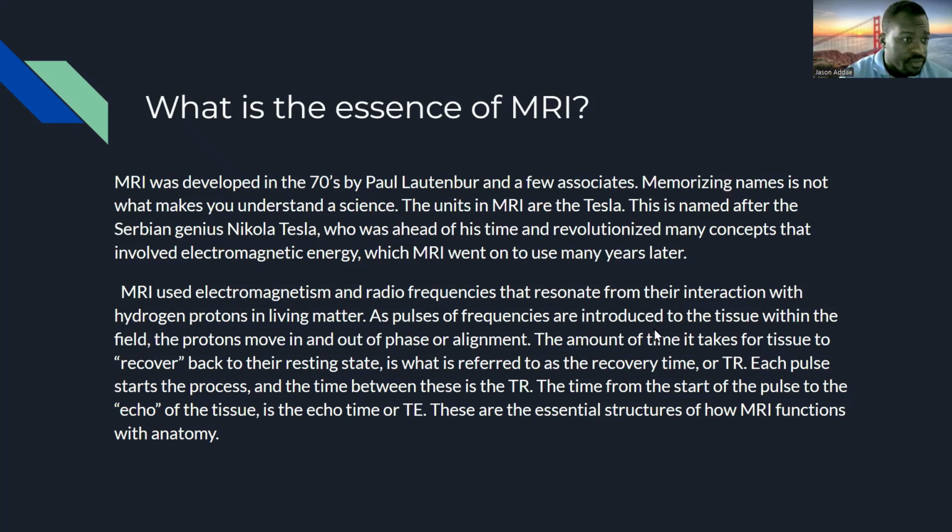Each pulse starts the process, and the time between these is the TR. The time from the start of the pulse to the time of the echo of that tissue, that's the echo time. I always imagine it like the consistency of matter, almost like catching up to something. What's going to bounce back to you more readily: throwing a ball off of water, or throwing a ball off of a wall? You're going to say it's going to bounce more readily back off a wall, right? Exactly. That will be a shorter echo time.